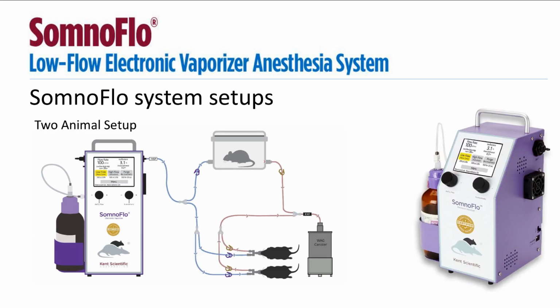And here again, we have the diagram showing you how a 3 accessory adapter can be used to connect the SomnoFlow to 1 induction chamber and 2 face masks, giving you again an additional station to work from.